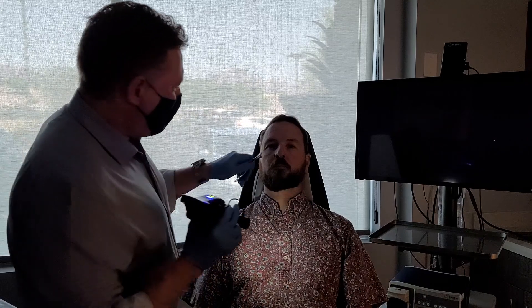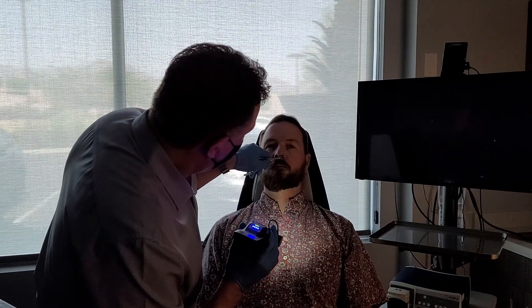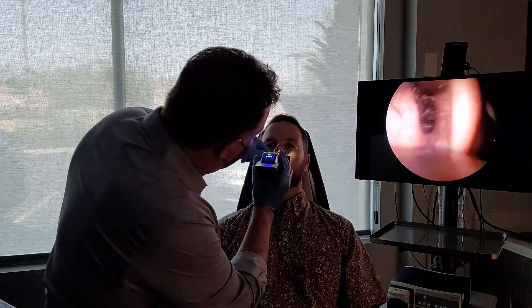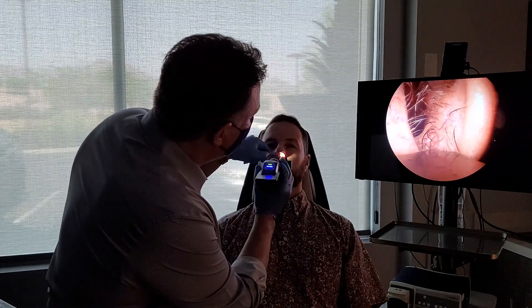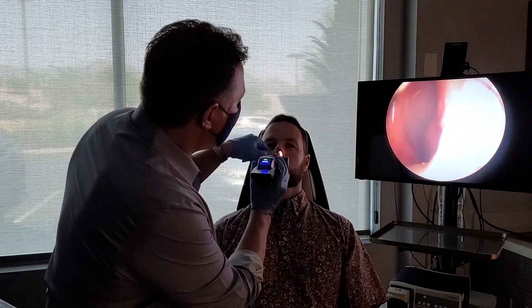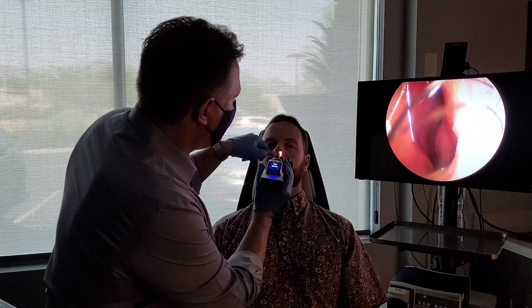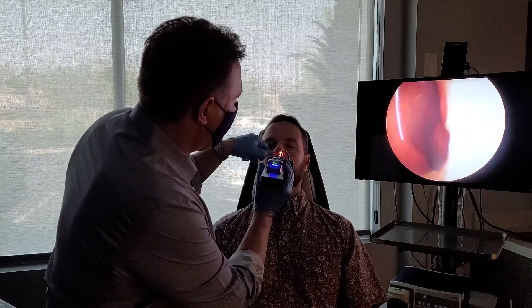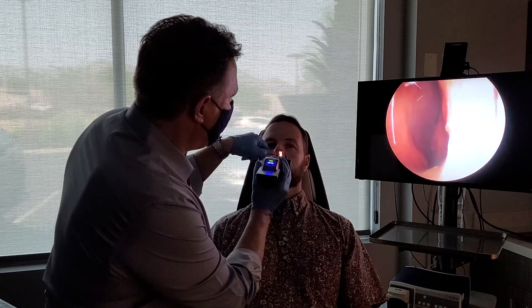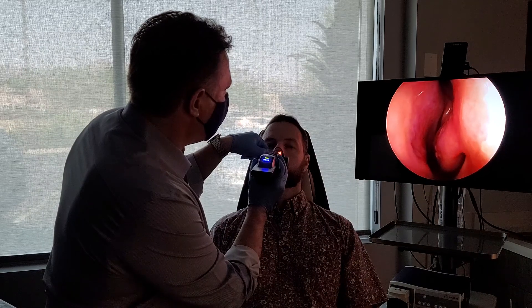The first thing I'm gonna do is gently apply this inside Kevin's nasal cavity — it stretches things open — and as I look inside we can see the nostril. That's about all I would see if I look inside the nose with my naked eye. The septum is on the left side and the inferior turbinate is on the right side. Just starting to get a little hint of the middle turbinate towards the back up around two o'clock.